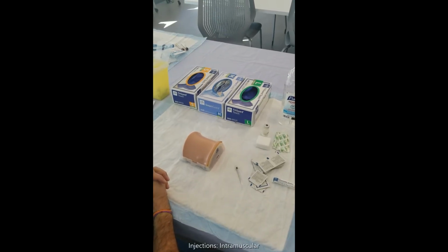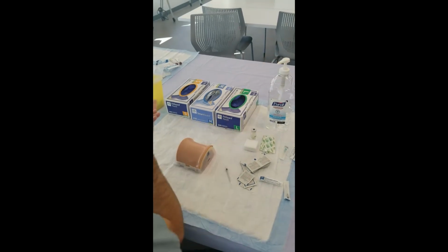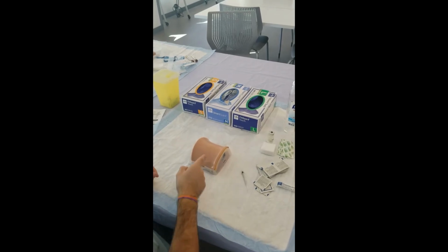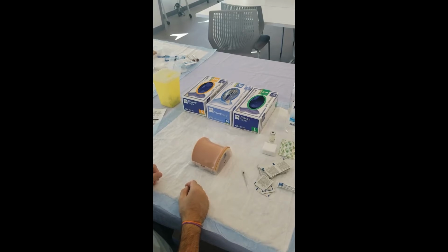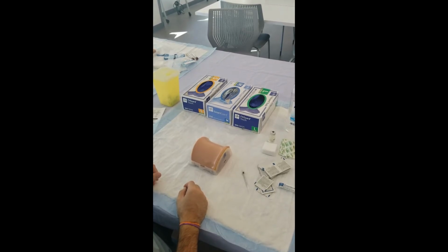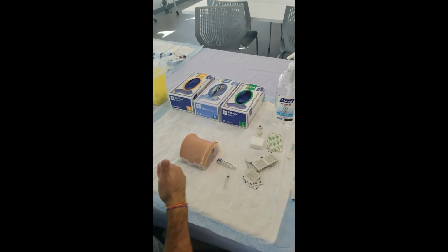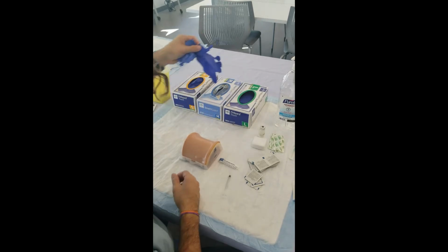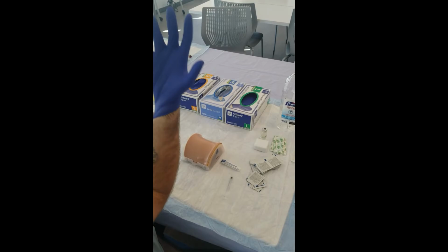Injections. Intramuscular. Step 30. Washed hands. Step 31. Identified patient using at least 2 identifiers. Items 32 through 34 can be done in any order. Step 32. Prepared all equipment. Step 33. Put on gloves. If student completed any of the other injection types and was wearing gloves, they may continue wearing the original pair.